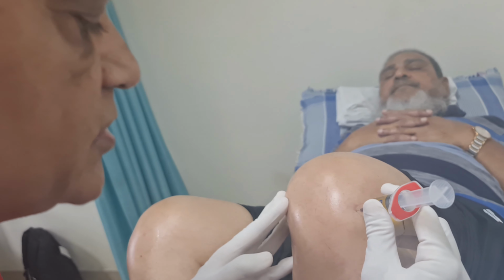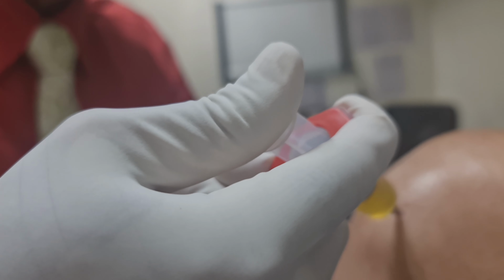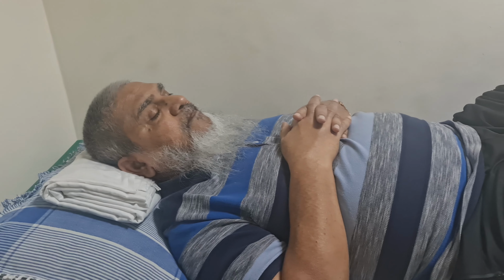Now I'm going to inject the needle into it. You can see that the patient is not having any pain. The patient is very comfortable. We clean up the areas and apply sterile dressings.